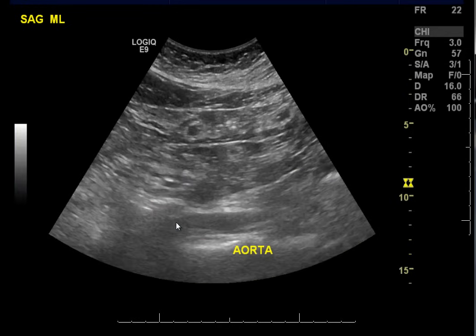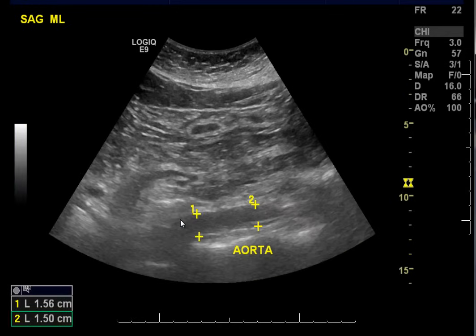Just remember, I showed you the cava on the other case — this is the abdominal aorta in a limited fashion.